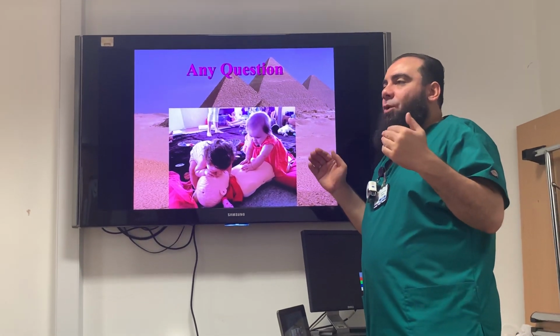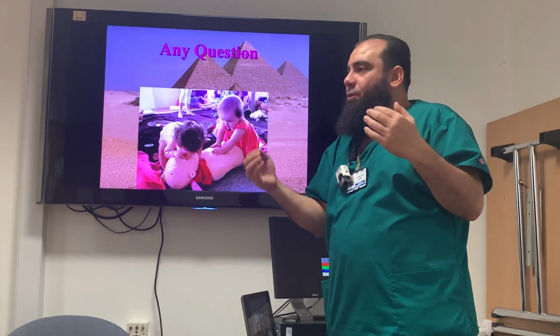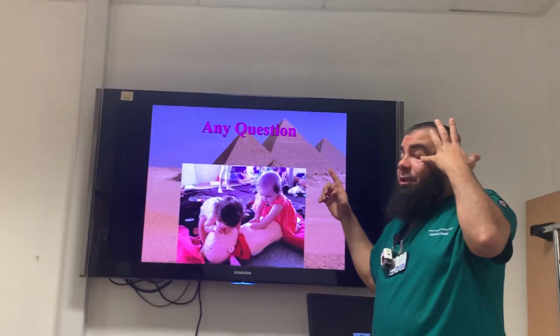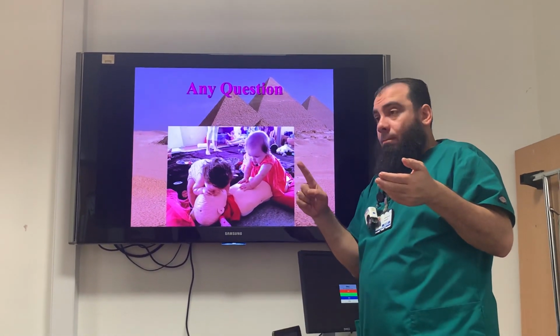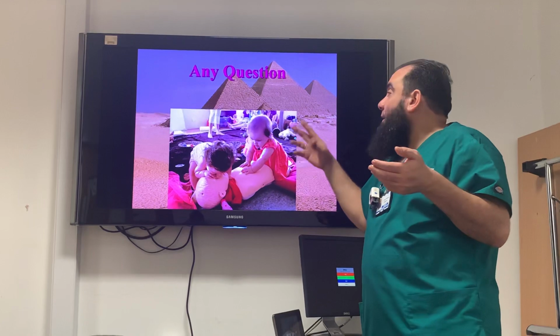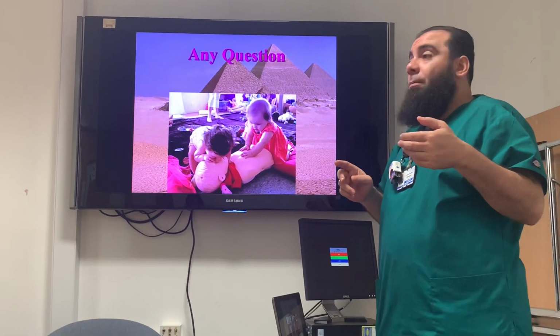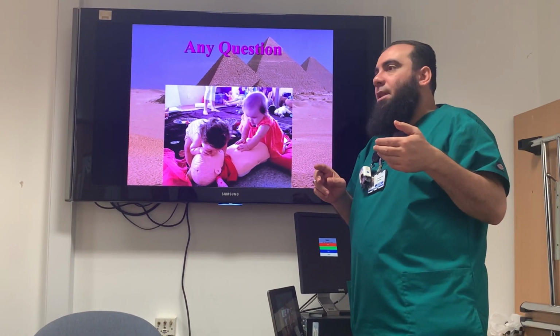So sometimes a slim guy can come to you with a high voltage ECG, and you can simply tell it is a hypertrophy, and it is a normal variant because he's slim. And you can find the criteria. You can calculate, for example, 35 small squares or more in him. But is it hypertrophy or because he's slim?